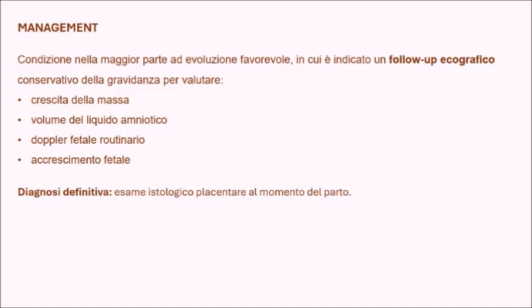And so the management basically consists of conservative ultrasound follow-up sessions, which aims to carefully assess any possible growth of the mass, the total amount of amniotic fluid, fetal Doppler, which in this specific case we saw was within the normal range, and the continuous monitoring of fetal growth. Obviously, the patient was advised to have a histological examination of the placenta at the time of delivery, since this is what allows for a definitive diagnosis.